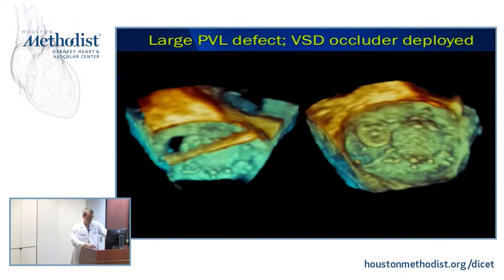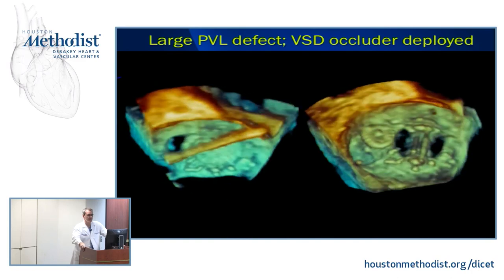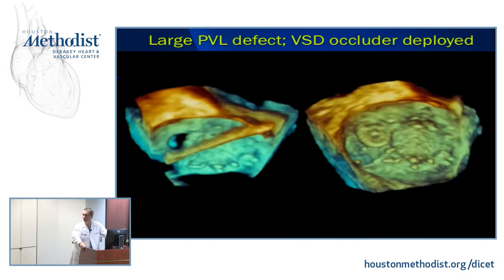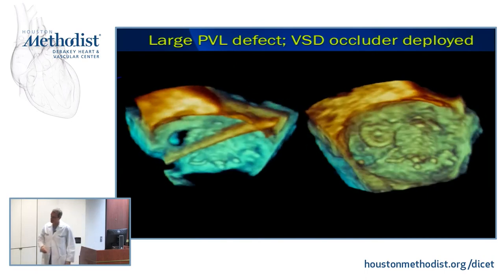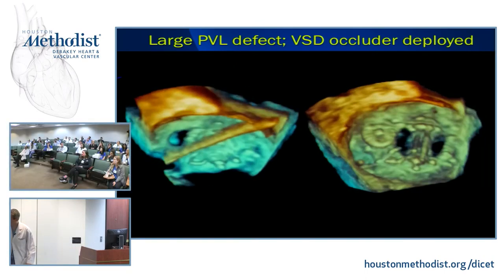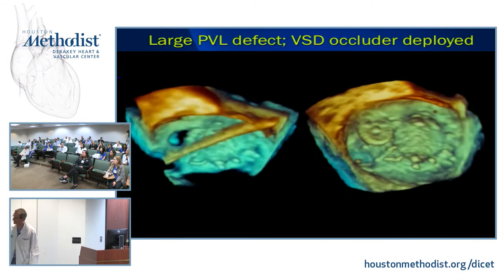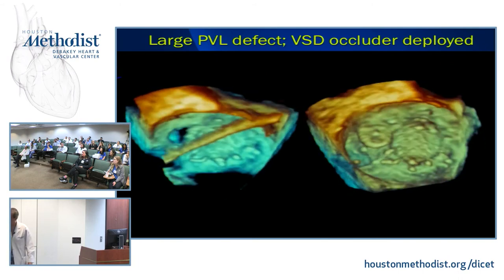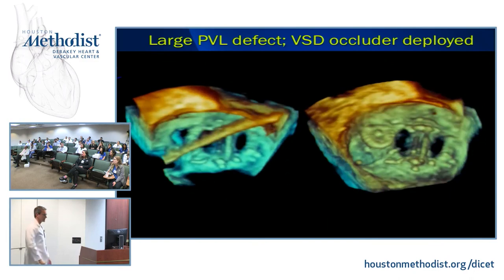So that's, I don't know, somebody in here is a man. He's doing our PVL workup. If we map out all of the spots where we get PVL, it's basically here, here, and here. I would say 90% of all the plugs we put in are right here, or right there. That's sort of the base of the appendage.